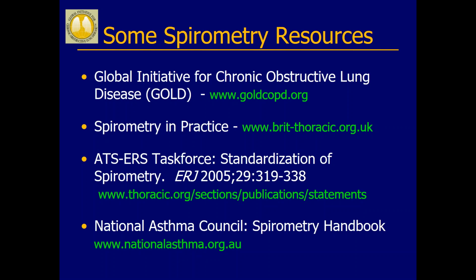I highly encourage you, if you've been doing spirometries at your site, to hold on to some of them to showcase what you have done before, what you considered good and what you considered bad, and what you thought was going on with the bad tracings. The on-site trainer can help walk you through what you could have done to prevent those types of episodes.